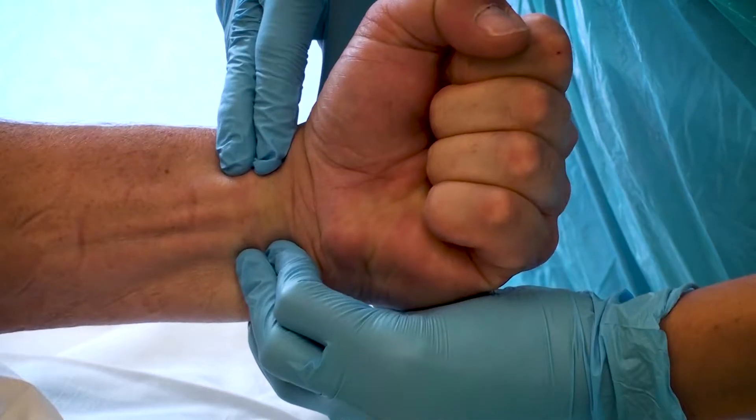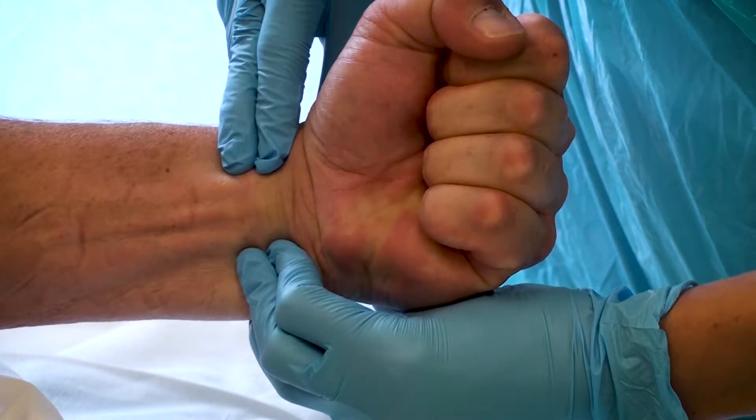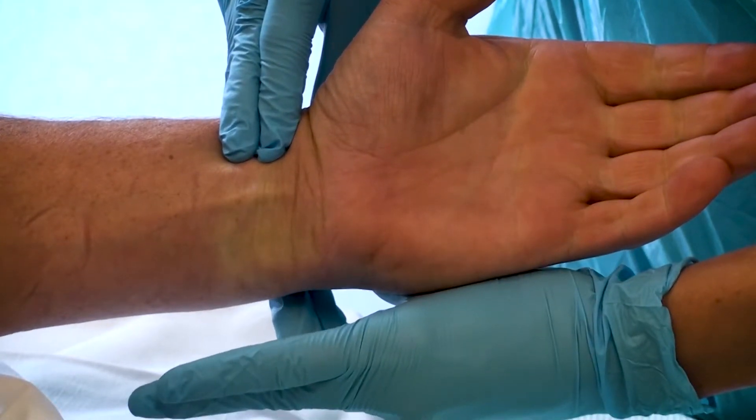Prior to the procedure you must perform the Allen's test. This involves asking the patient to make a fist, then occluding the radial and ulnar artery for about 30 seconds. The hand is then opened and should appear blanched. Pressure is then released from the ulnar artery and the colour should return to the hand within 5 to 15 seconds. If the colour returns as described, the Allen's test is considered normal. If the colour fails to return, the test is considered abnormal and we should not proceed with the ABG in this limb.